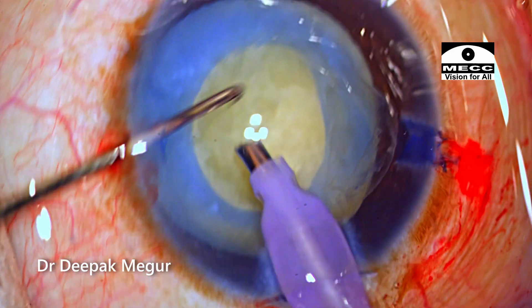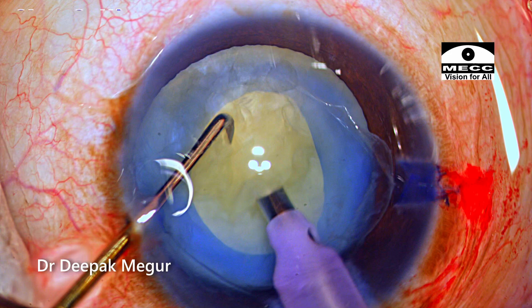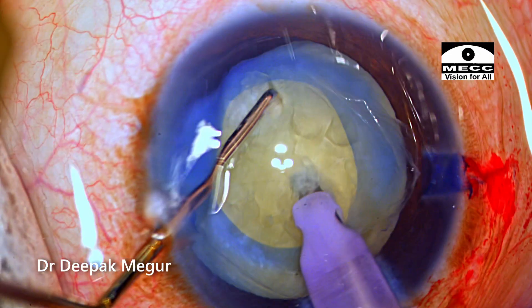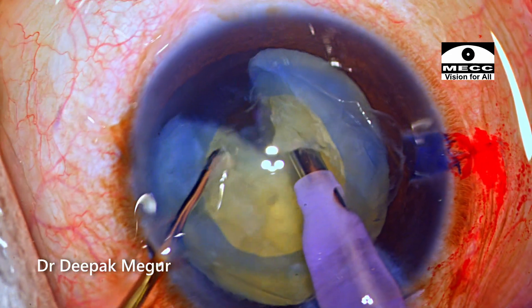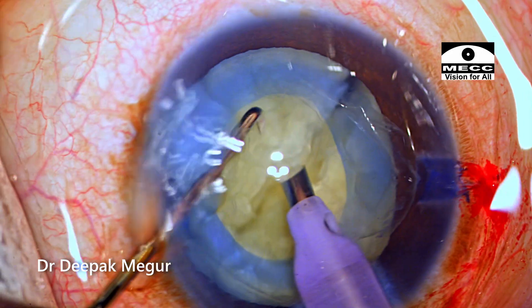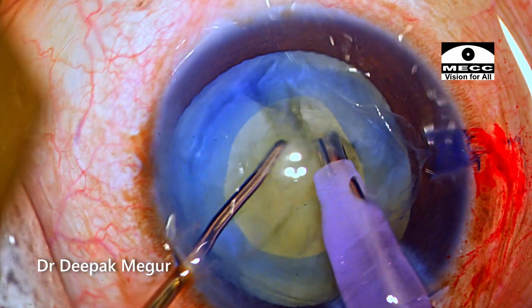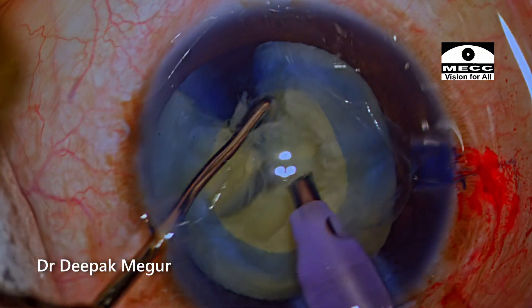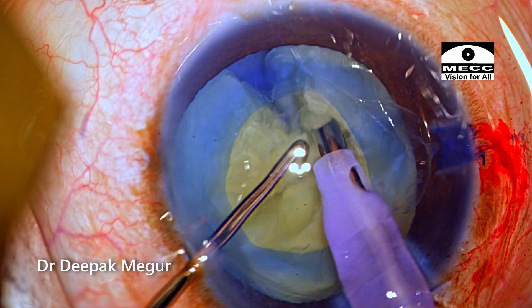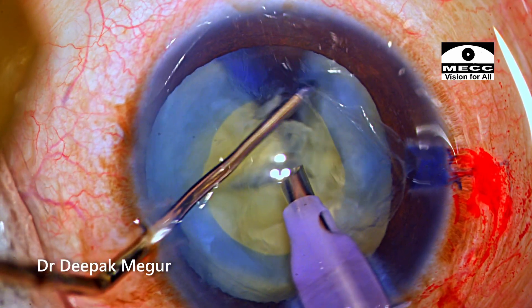This patient's nucleus is not very dense — it's probably the most ideal density nucleus to chop. The left hand, that is my chopper, is going down beneath, nearer the posterior plate. And when I reach there, the amount of energy required is extremely less — it just separates with the minutest of touch. Keep an eye on the chopper, whether it is touching the rhexis margin throughout the procedure.